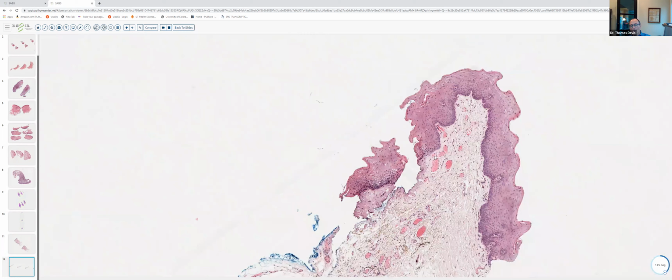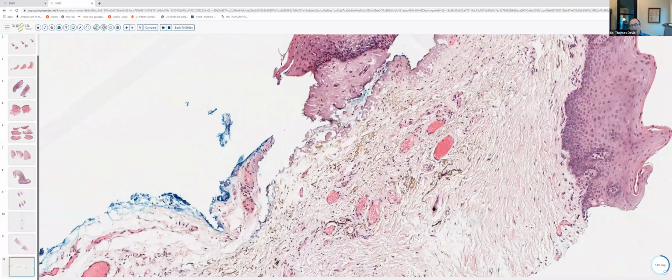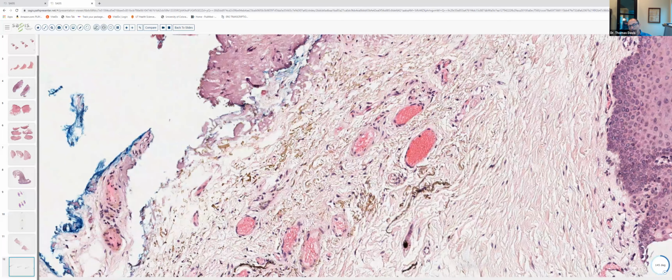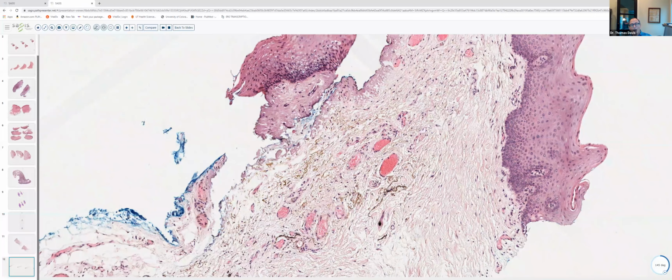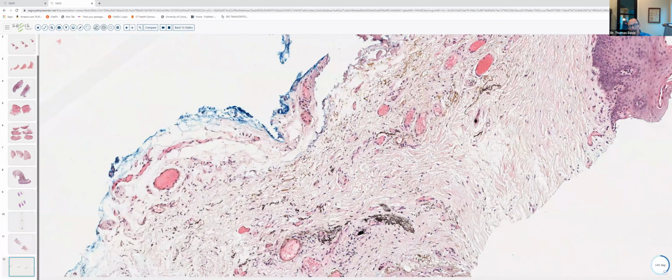This was oral mucosa. And hopefully you noticed right away within the dermis, kind of these yellow to yellow-brown to dark brown linear structures and black fragments and granules that were present free in the dermis or in many instances kind of deposited on these connective tissue fibers in the dermis. And they're present very, very deep in the tissue all over the place. And this is an amalgam tattoo.